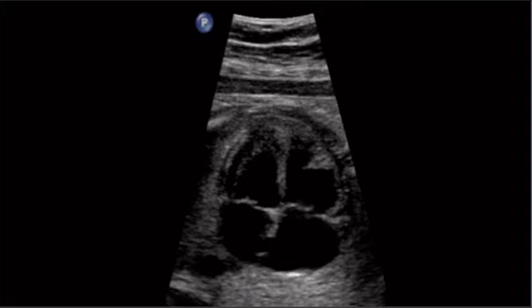So just like cardiac MRI, you've got standard views of the heart, okay? And this is one of them. This is a 4-chamber. And this is the money shot. This is sensitive for detecting 75% of the problems.